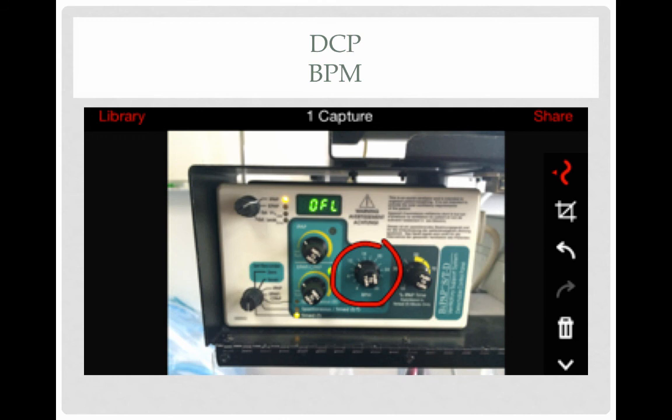The next control is the IPAP percent control. This is only active in the timed mode, and it lets us determine how much of the breath is going to be IPAP and how much of the breath is going to be EPAP. And that percentage is also based on the breaths per minute we set.